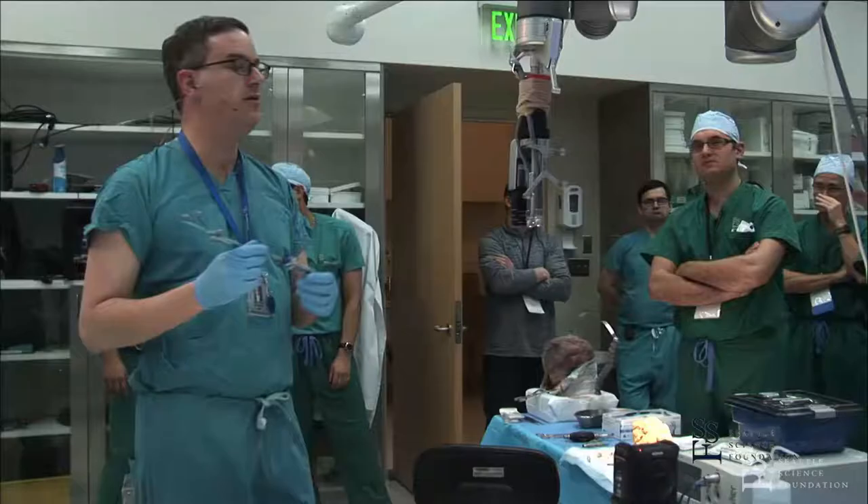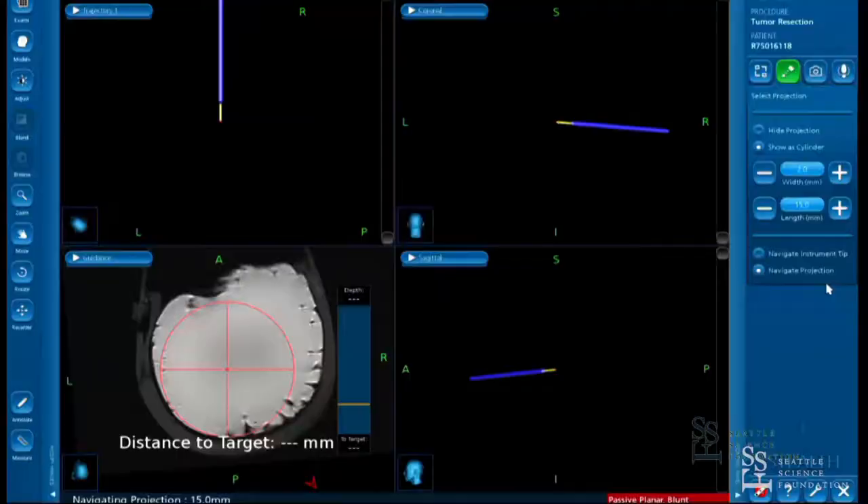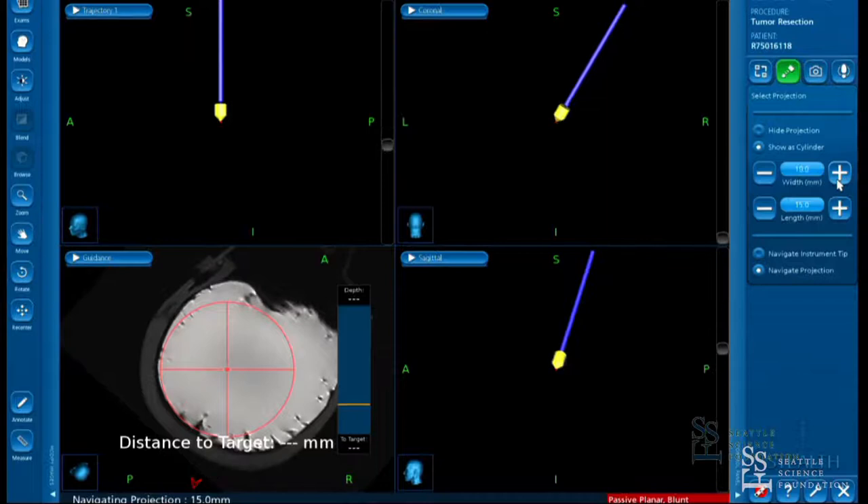It's shown as a 13 millimeter cylinder to approximate the diameter. You'll see that now we have a sort of pseudo real-time navigation of the very tip.